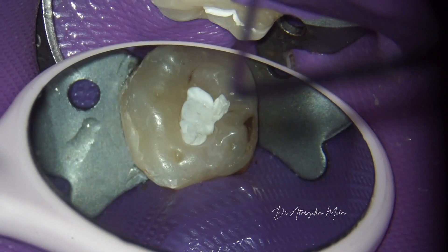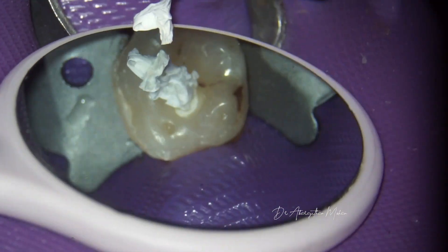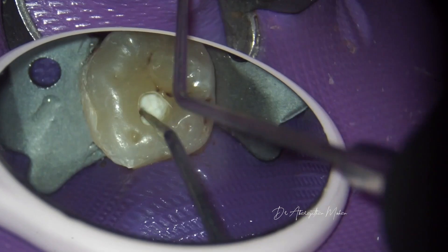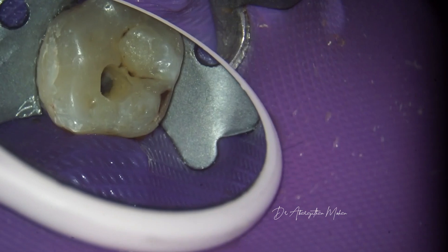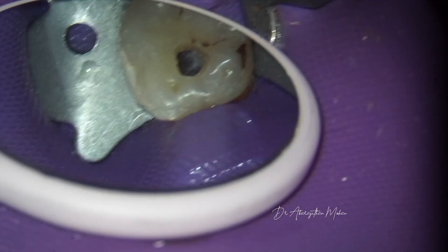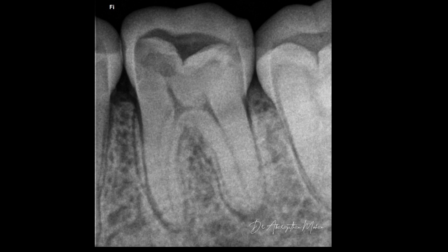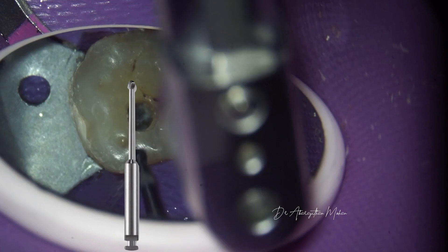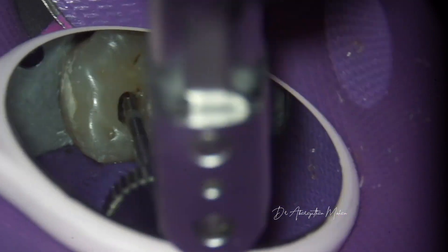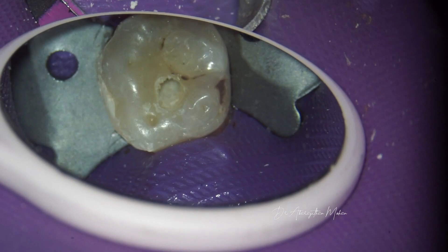Once isolation is completed, all the Teflon is removed from the pulp chamber. You can see the pulp chamber has been nicely protected from blockage by the Teflon. Also note there is a pulp stone in the distal pulp horn, which is carefully removed with a long neck bur to remove the obstructions above the distal orifices.